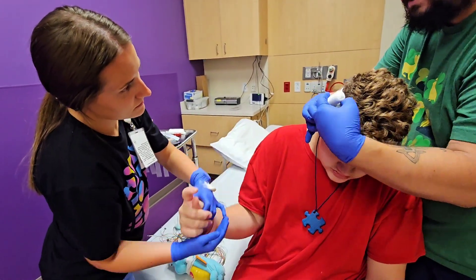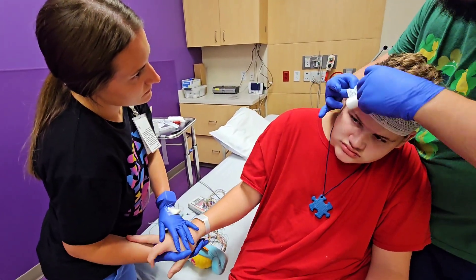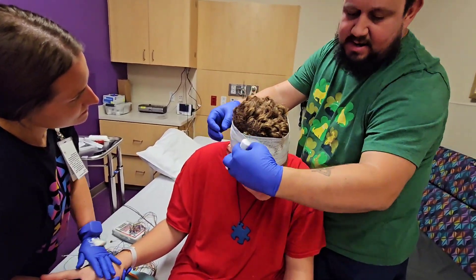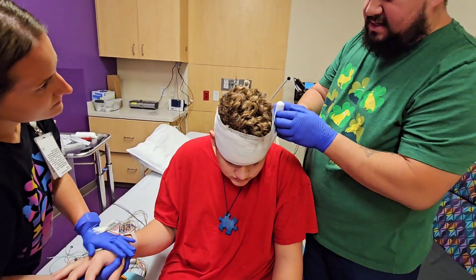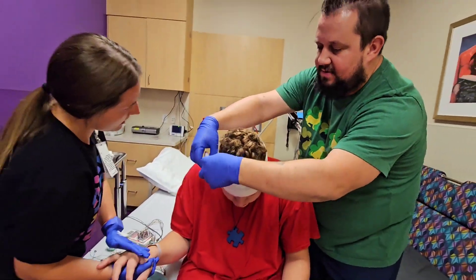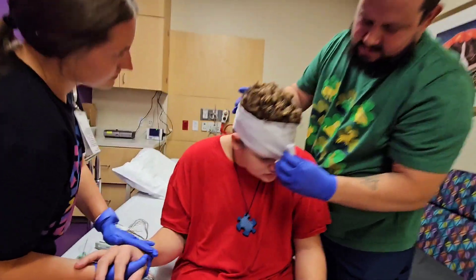No, no, no — this is it, feel it, it's just a hat. That's it, baby, here you go. Good job! See, good job JJ — it's like a hat and it stays on right here. Good job JJ! Wow, this is a hat — it's like giving you a hug, huh? It's hugging your head right here.